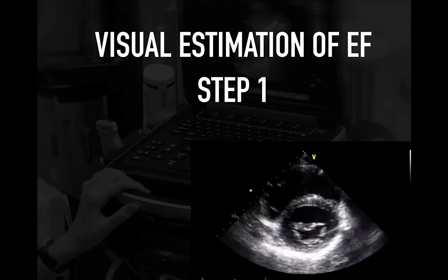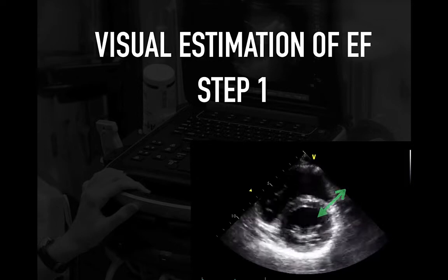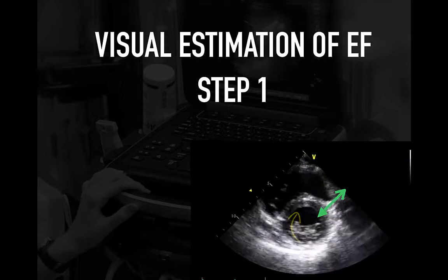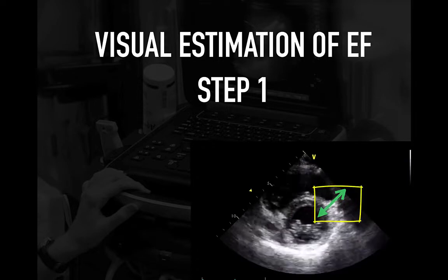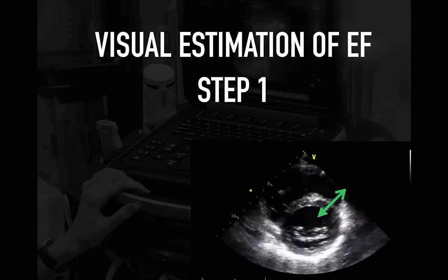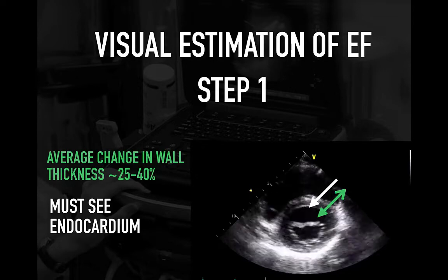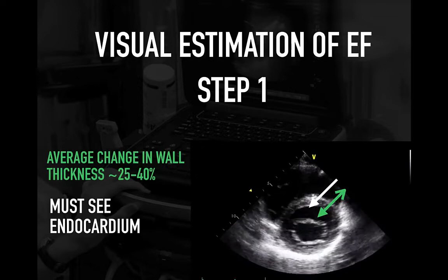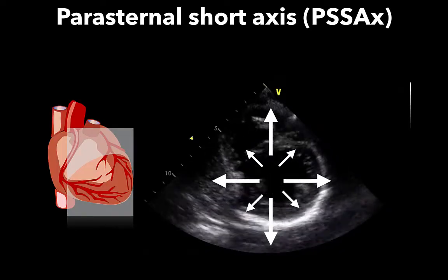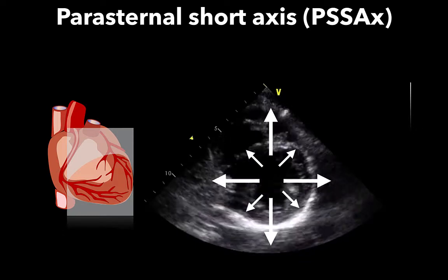Step 1: we'll focus on wall thickness. In most cases, a visual 2D assessment will do. You need to clearly see the inner endocardium at the border of the inner left ventricle. A change of 25% to 40% of wall thickness is considered normal. You have to make sure you're cutting the LV along precise planes, as being off-axis can limit your assessment. You want to look at the walls in isolation — ask yourself: are they really normal? Do they move at the same time, with the same amount of thickening? This begins to train your brain and eyes to interrogate the left ventricle.